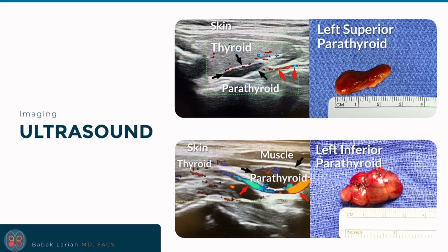And there are more examples of this. Thyroid gland, which you see here, and then the parathyroid underneath it, which during surgery, you can see is very much the shape of the parathyroid that was removed. Again, here, the parathyroid seen on the scan with a white shadow, right? And then when you took it out, it's almost exactly the same shape. And I know where the blood vessels are in relation to it. So I really think ultrasound is fantastic.